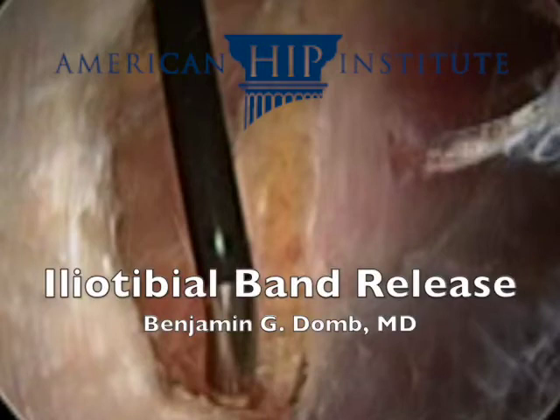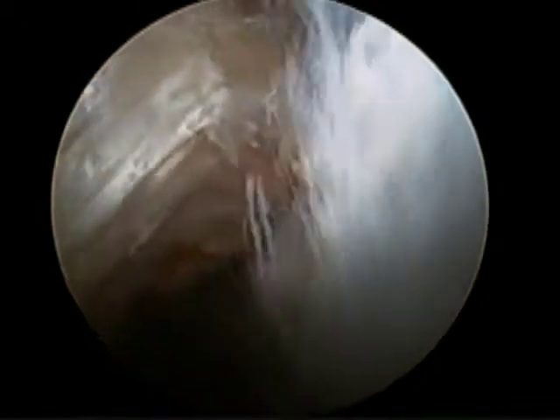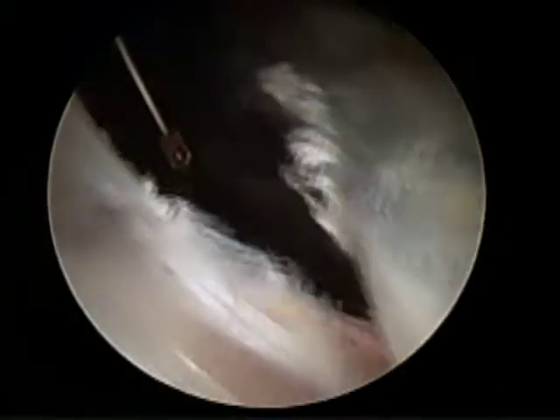This is a video demonstration of iliotibial band release for external snapping hip. We begin by visualizing the IT band on the left and the vastus lateralis fascia on the right.